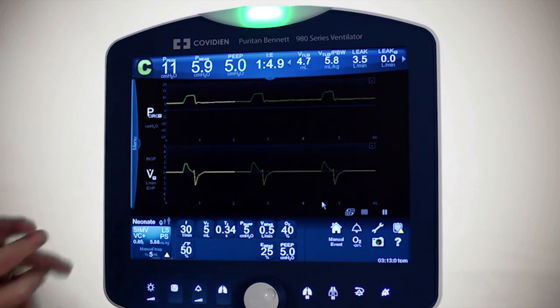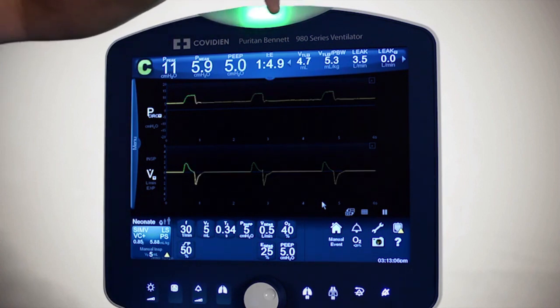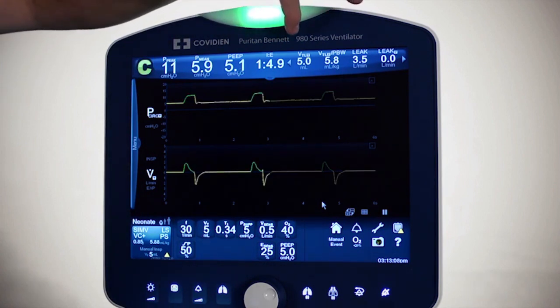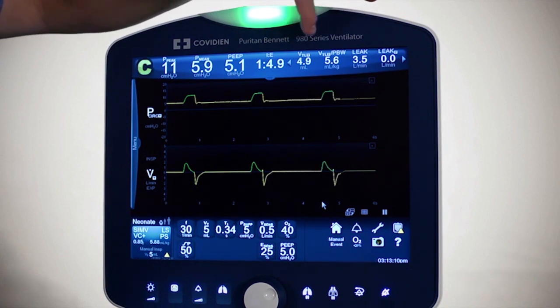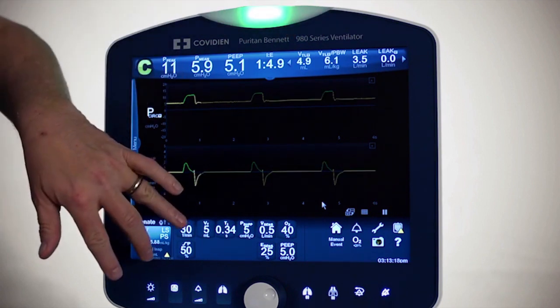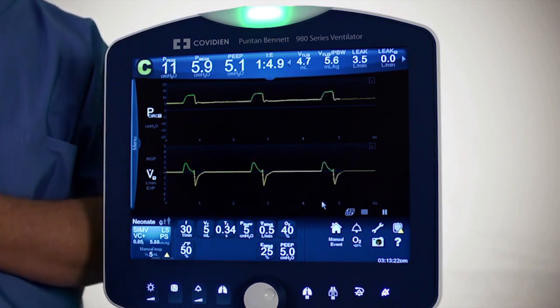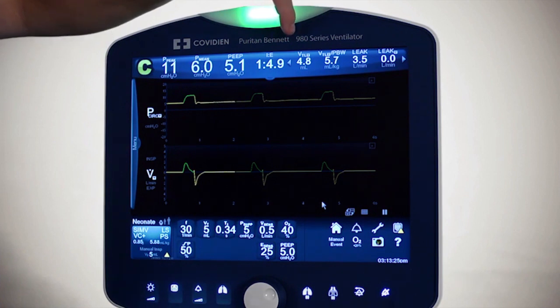Looking at the information on the top, you have your traditional information, but you will note there is a designated Y after some of the parameters. For example, the ProxFlow measured delivered volume is 5.0, set on 5.0. So you have a nice independent measurement of the inspired volume for your patient — we measure the inspired volume here.